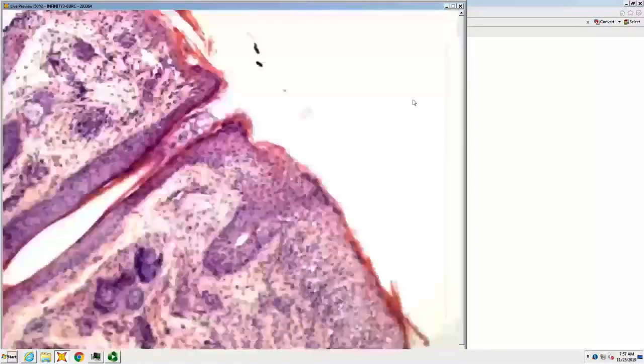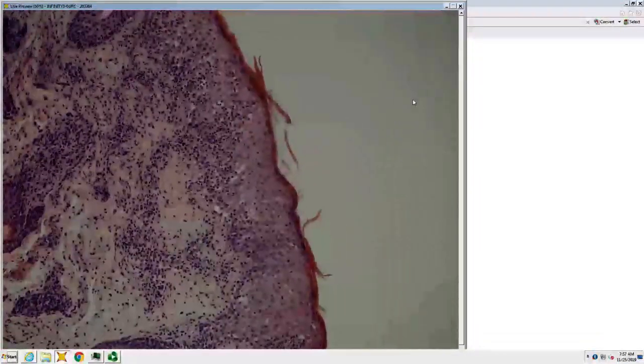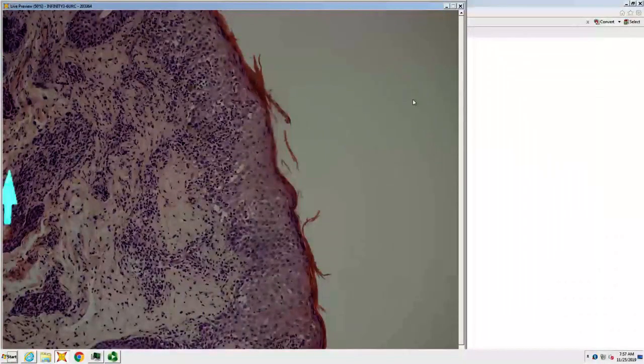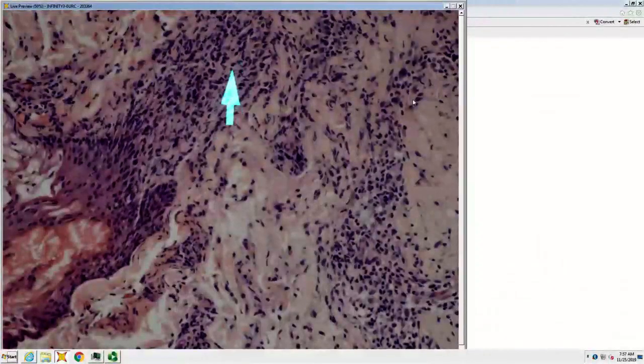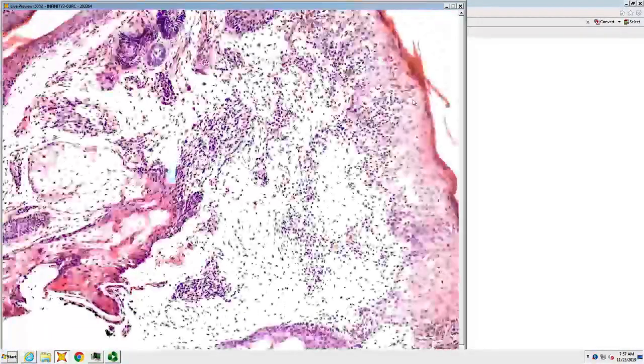There's some inflammatory cells. Lymphocytic infiltrate at the DJ. Yep. And where else is the infiltrate? Kind of a poorly looking adnexal structure there. And the infiltrate, if you had to characterize that infiltrate, is it lymphoid or neutrophilic? That looks neutrophilic there. Kind of crushed, but I'd say they're lymphoid. And crushed lymphoid sometimes is a clue to lymphoma, so you'd have to consider that.